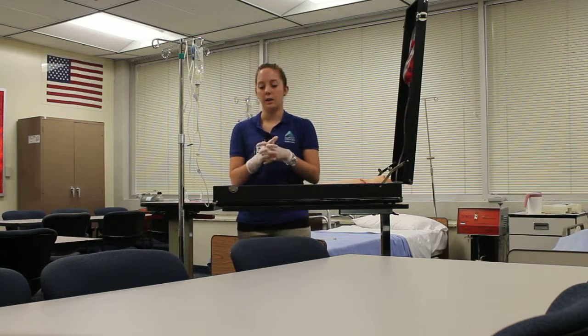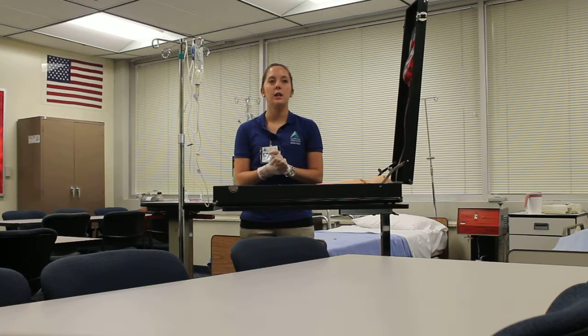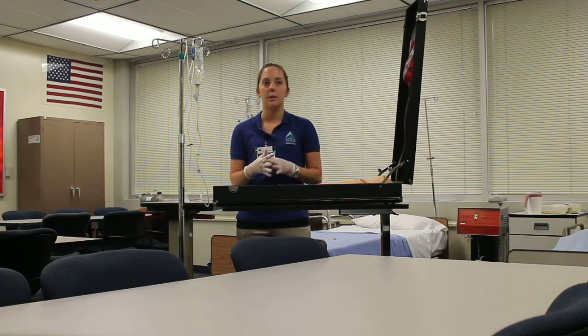I can go ahead and I'm done at this point. I can take off my gloves, perform hand hygiene again. I'm going to go out of the room. I'm going to document the drug, the route, the dose, and the time, as well as the condition of the IV site and the intake and output.